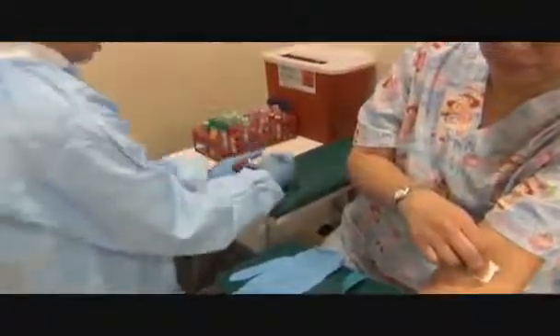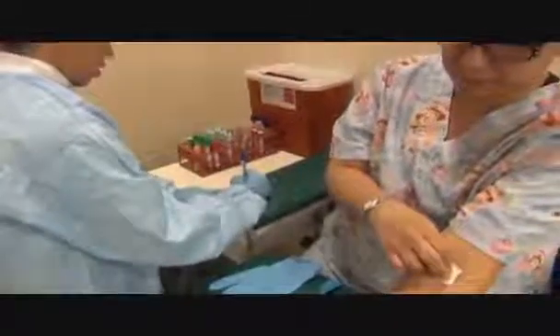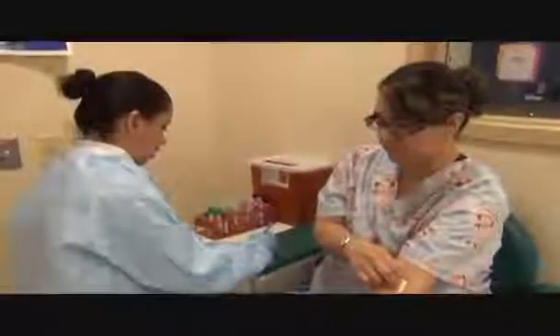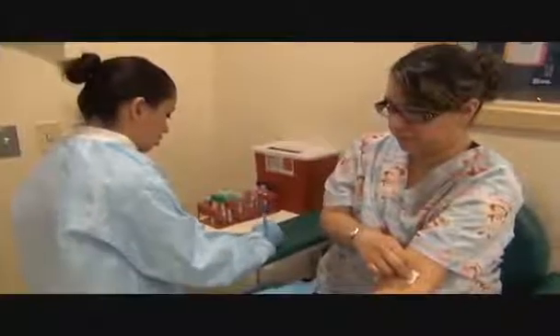I am now adding the medical record number, the date, and my initials along with the time.